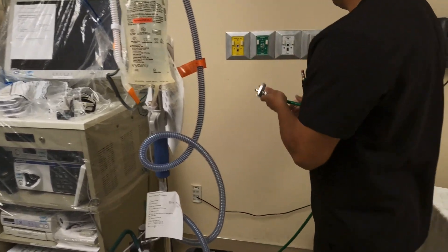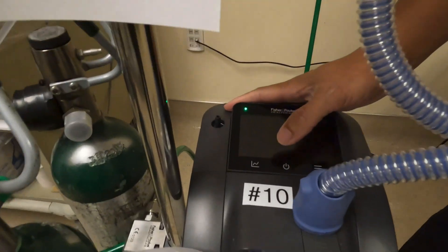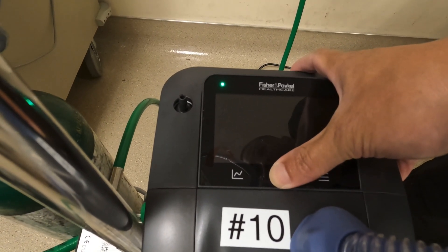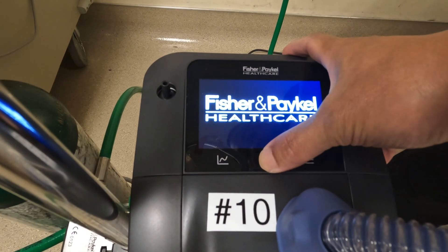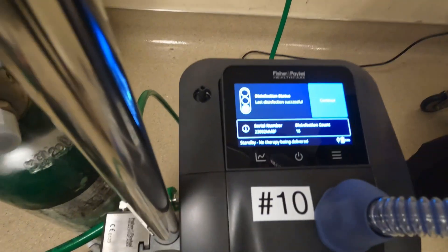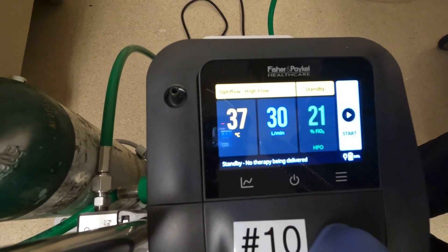Then you're going to plug in the oxygen. To turn on, you're going to press the middle on/off power button and hold down for two seconds. As you turn it on, it's going to ask whether it's going to be the same patient or new patient. This indicates that the disinfection process was previously done, so it overrides that and goes straight into the settings.